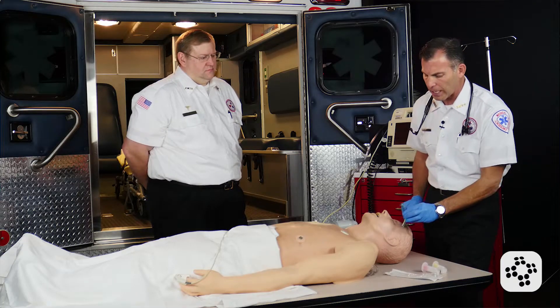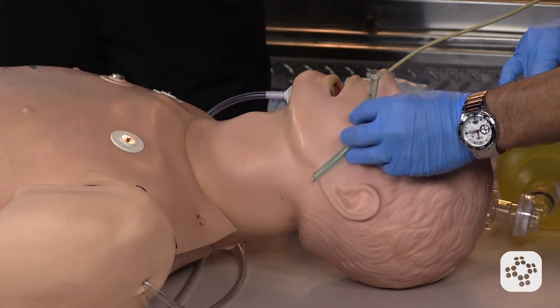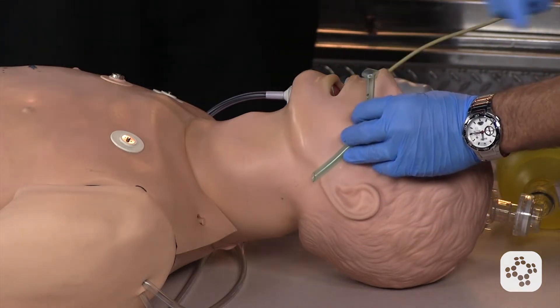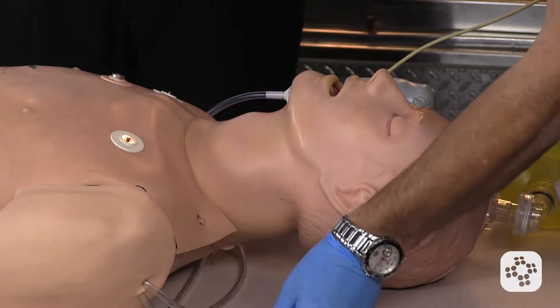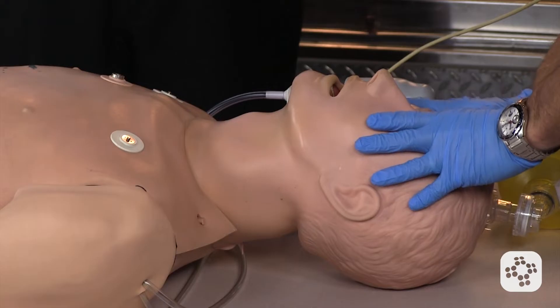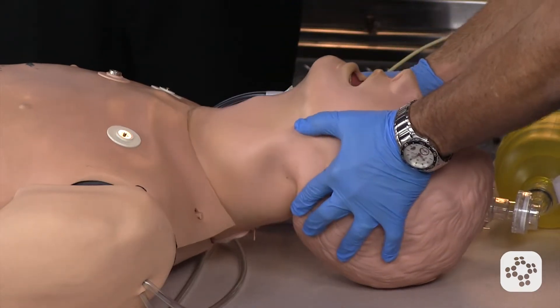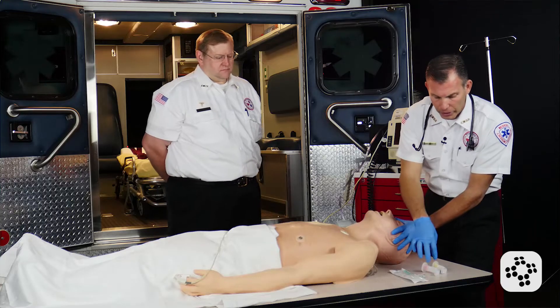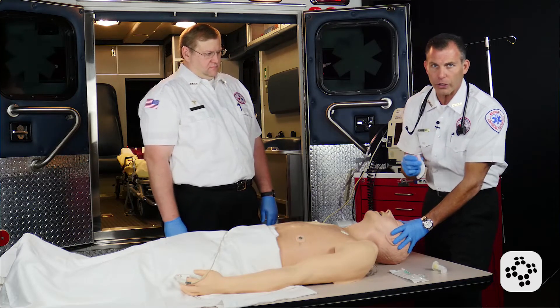They tolerate the nasopharyngeal airway while they're still semi-conscious. The way to measure it is from the edge of the nostril to the ear lobe. As you can see, this nasopharyngeal tube would be about the right size. But because I believe this patient is unresponsive and probably doesn't have a gag reflex, I'm going to do a head tilt chin lift and prepare to use what we call an OPA, or oropharyngeal airway.